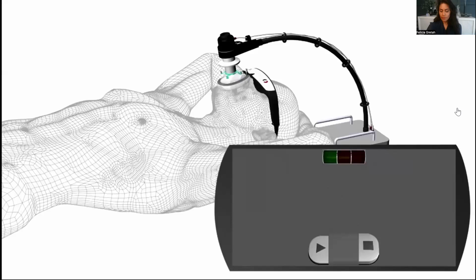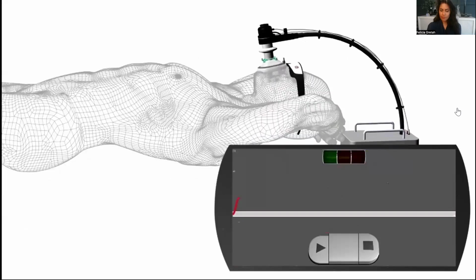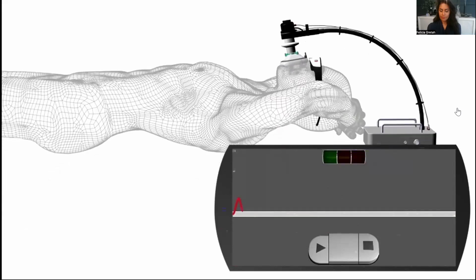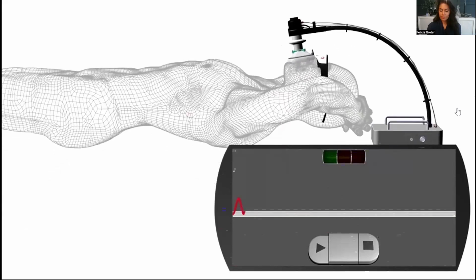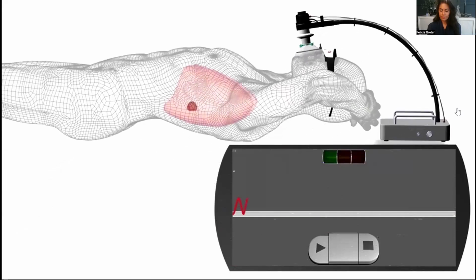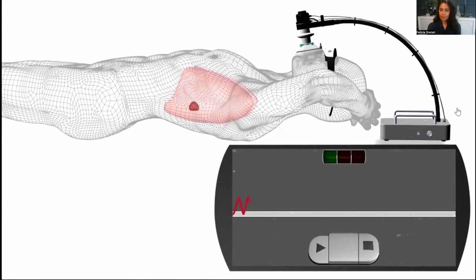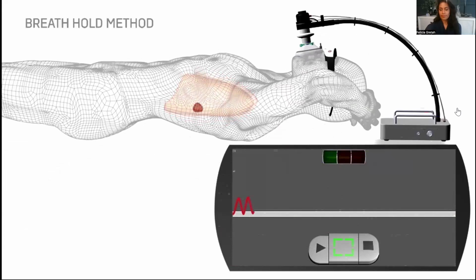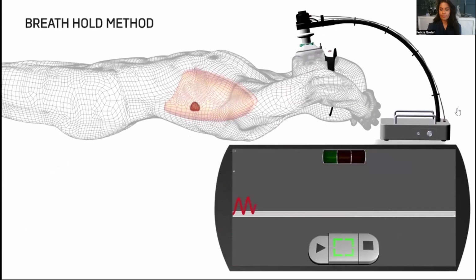Let's take a further look at the images on the screen. As you breathe, you'll notice a red line climbing and falling. The climbing portion represents your inspirations, and the falling line represents your exhalations. It is not important to be able to see any numbers or words. You'll want to focus on breathing as normal as possible. Allow your expirations to end within the gray line at the bottom of the screen.